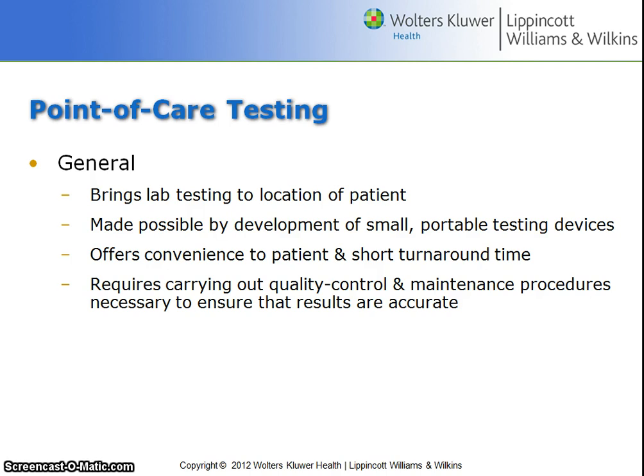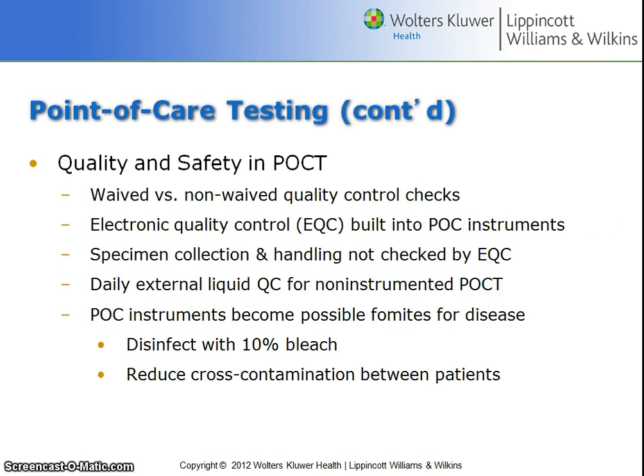Point of care testing. This brings lab testing to the location of the patient, offers convenience to the patient and short turnaround time. Not all tests can be done this way, but there are some that can. Quality and safety in point of care testing.